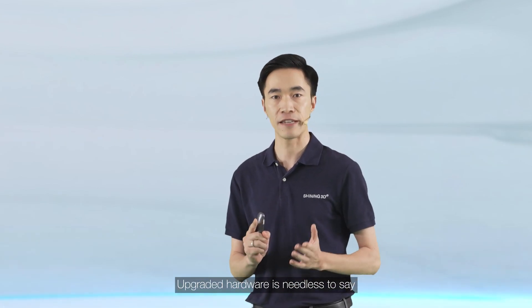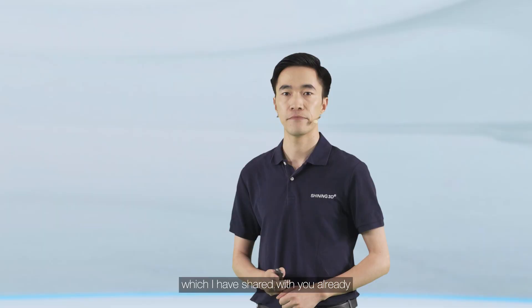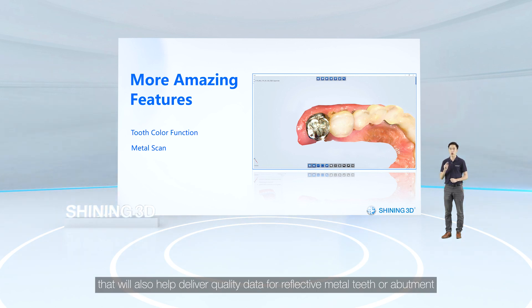This exceptional result is made possible due to several factors: hardware upgrades, a greater scan field of view, a tooth color function that guides you where to add a scan to capture optimal data, and an enhanced metal tooth scan function that helps deliver quality data for reflective metal teeth and abutments.